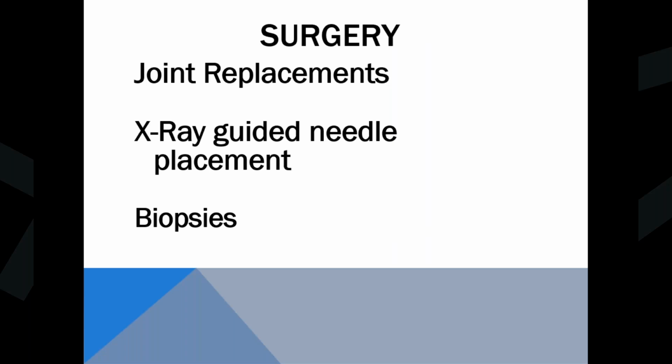Another area that they'll do is X-ray guided needle placement. So if they're doing injections in the joints or other procedures, then the X-ray will help the surgeon or radiologist guide the needle to the exact spot that they need to go. And then also biopsies, so they can do a needle biopsy, go to that part of the body, get a sample of the tissue they're looking for, and then pull it out without having to open the patient up.